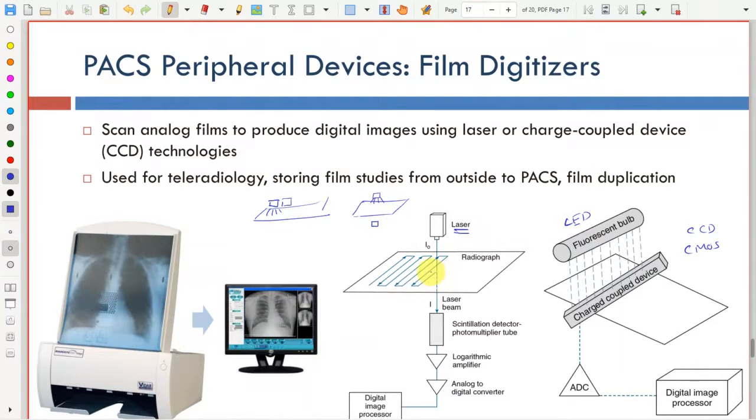Okay, so this is much higher resolution. But the point is here it's much faster, and the quality is usually very good. I personally have one of these scanners, and actually used it to convert some films into digital format, and it's really good. The resolution is really okay.